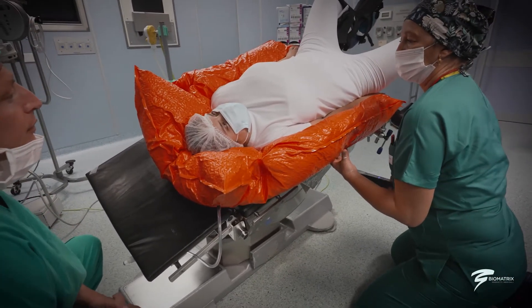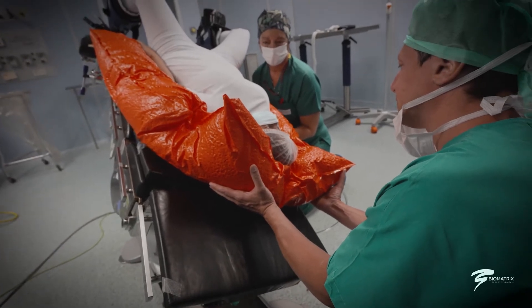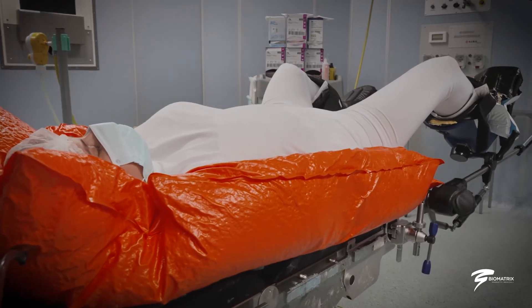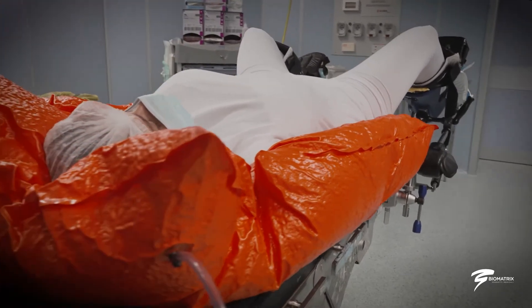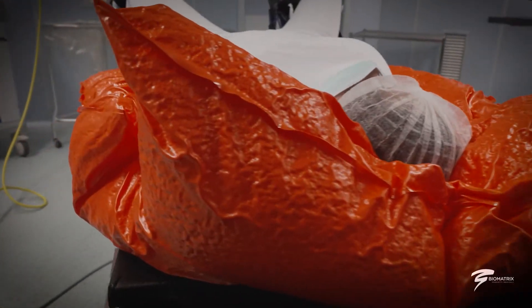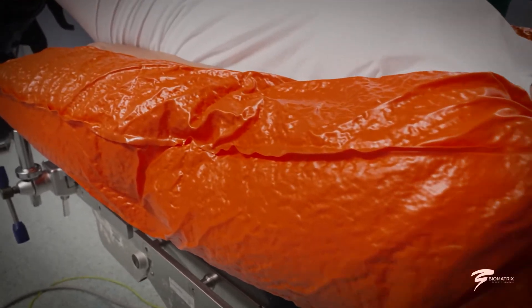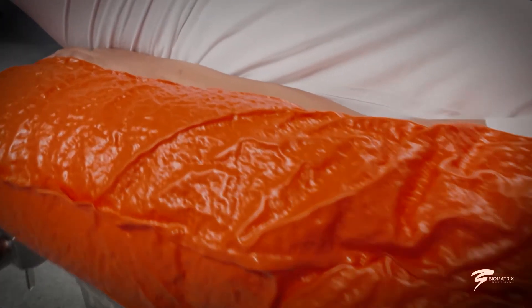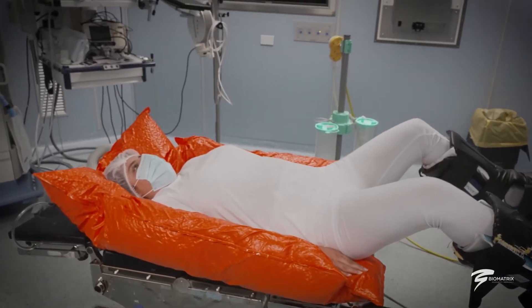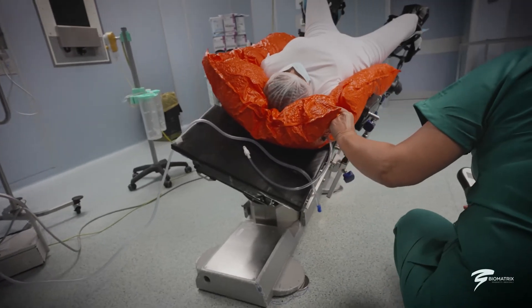Its internal composition is made up of expanded polystyrene microspheres. During air depression, it optimally stabilizes the patient, ergonomically adapting to their anatomy and position. If deemed necessary by the surgeon, the sedated patient can in fact be repositioned without the vacuum being removed.